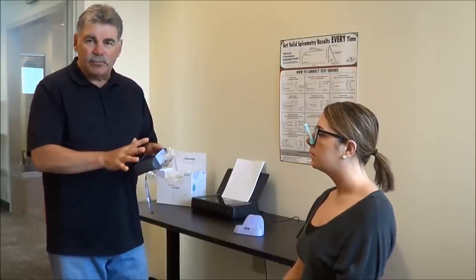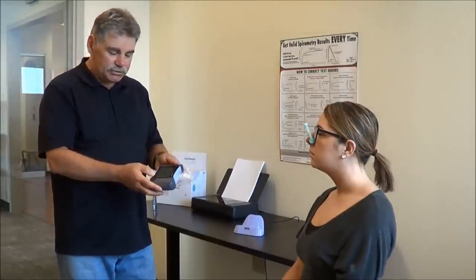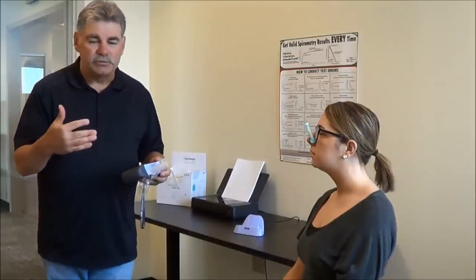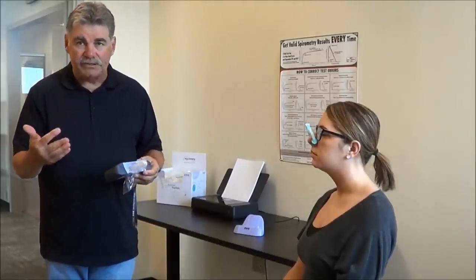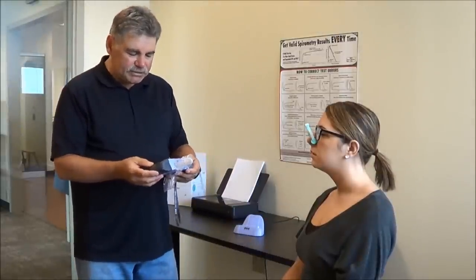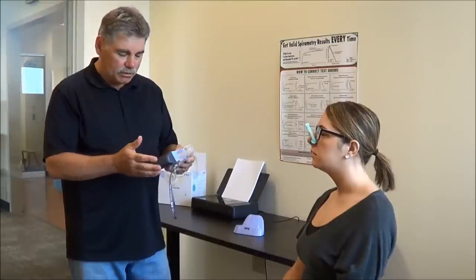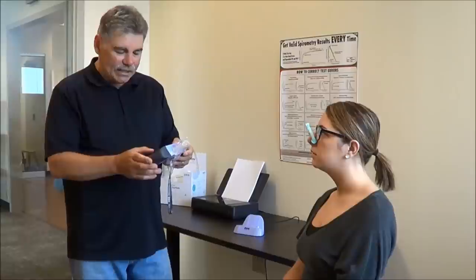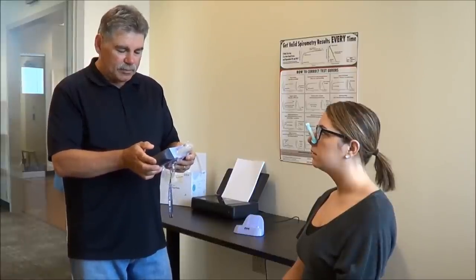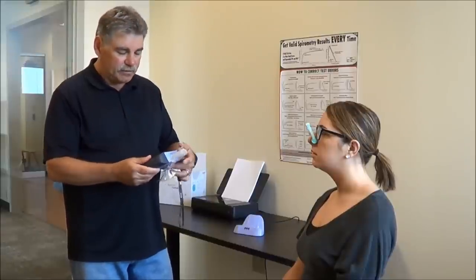Once I'm done entering the patient information or choosing the patient, I'm going to choose start test. I've already chosen to do the most basic spirometry test, called FVC, or forced vital capacity. The first step is asking me to block the flow tube on the first blow. I've got my bag on there, so I'm going to say okay. A couple of seconds after the baseline is set, it's telling me that it's ready for the blast.